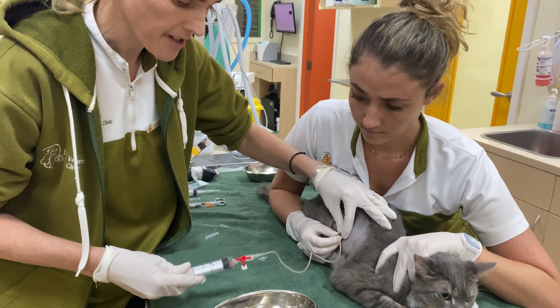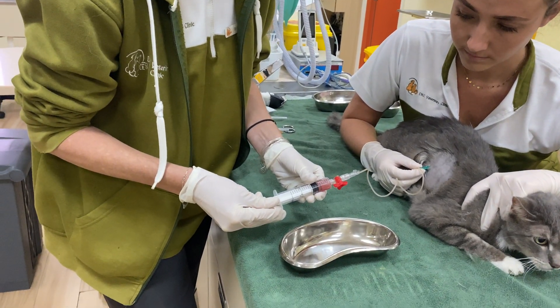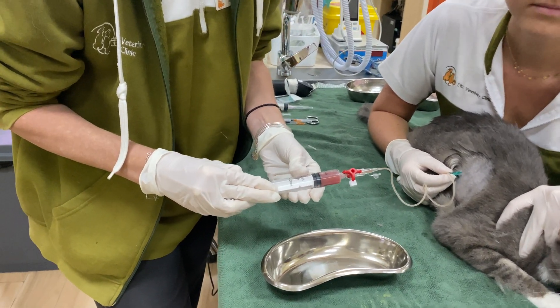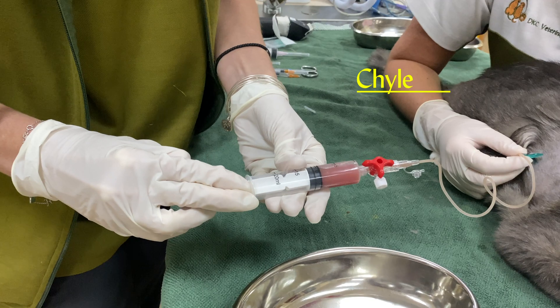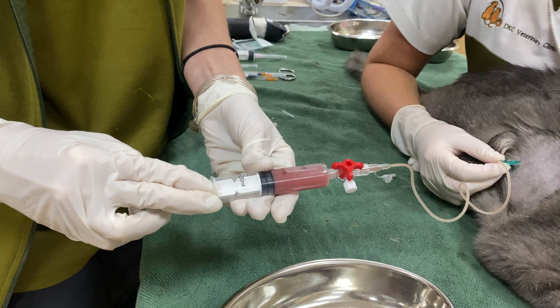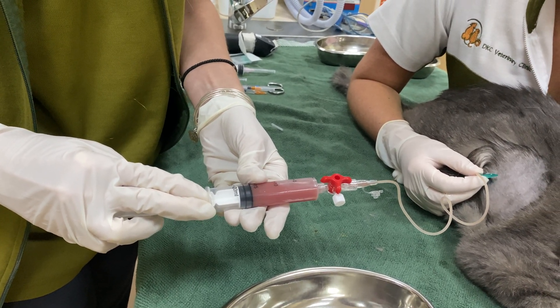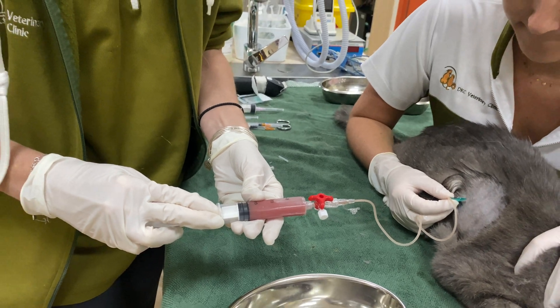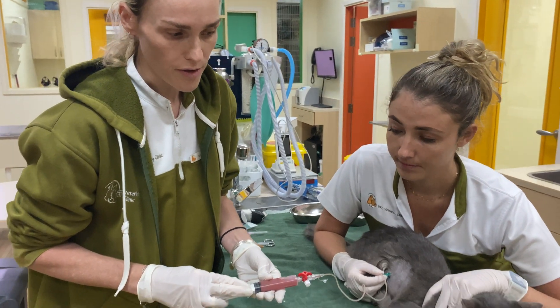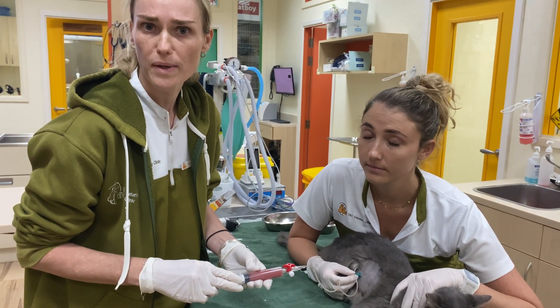As you can see, we are actually drawing back a lot of liquid. This is a milky, pinkish liquid, which is what we call chyle, and Puma will start to feel a lot better as we remove this. As you can see he's a little bit unhappy there, but we'd much rather do this without him having to go through any sedation, given the risk of him not coping well with his heart condition.